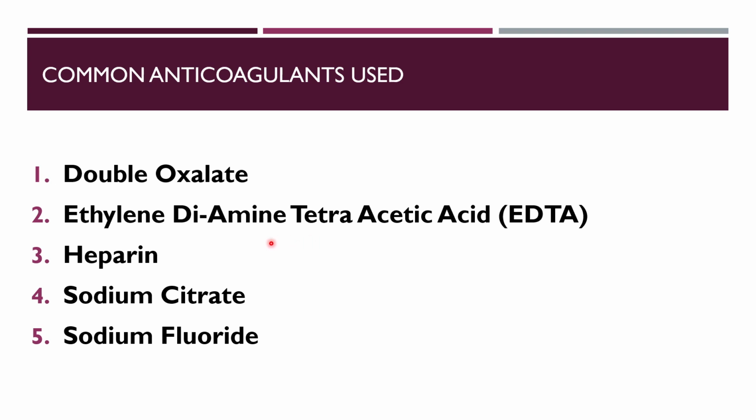There are five standard anticoagulants which are commonly used in any clinical laboratory: double oxalate, EDTA, the full form being ethylene diamine tetraacetic acid, heparin, sodium citrate, and sodium fluoride. So let's check them one by one and their importance.